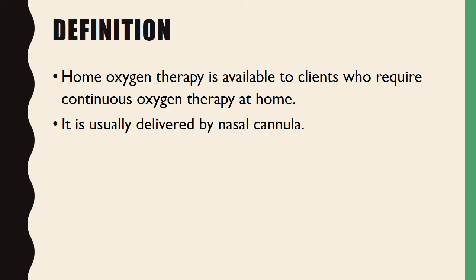In home settings we can administer oxygen. The oxygen delivery system is usually through a nasal cannula.